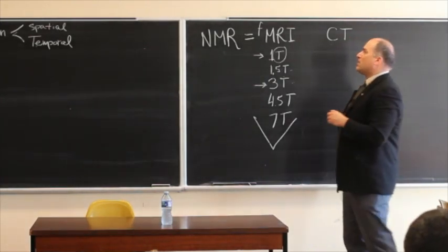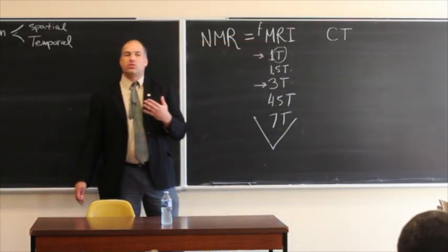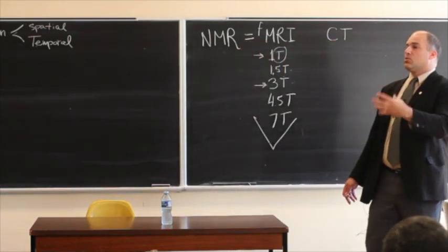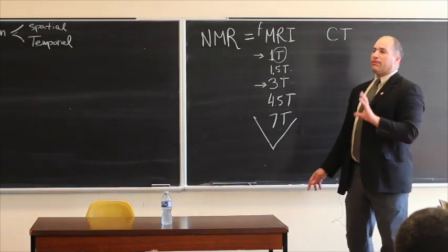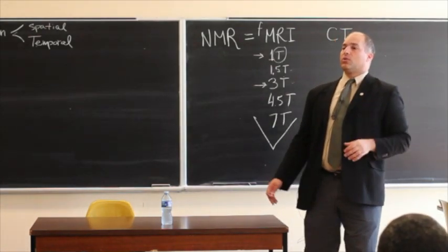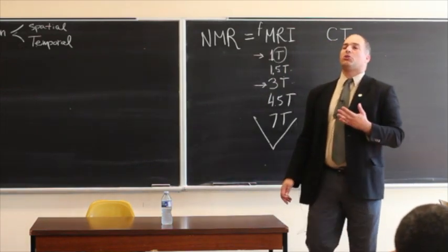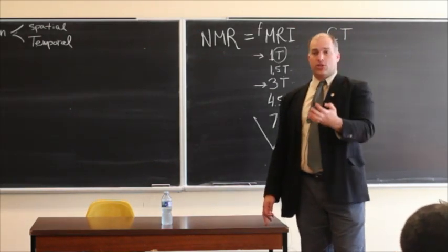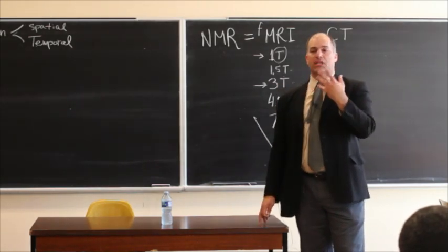And it allows you to see a particular form of a metabolic change. And that metabolic change has to do with oxygen consumption. It has to do with how things are being consumed over time. And that goes back to the idea that I mentioned before about the fact that when blood is oxygenated and when it's less oxygenated, it has different properties. Now, when we're doing MRI, how oxygenated the blood is not really important, because we're not looking at blood. We're looking at structures. When you do MRI, you're only looking at structures. Okay? And the structures have spins, and those can relax or not relax, but blood is not the issue.